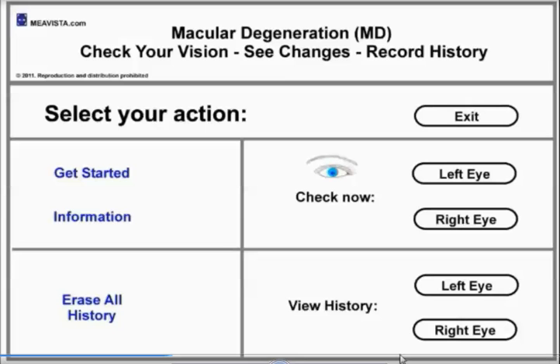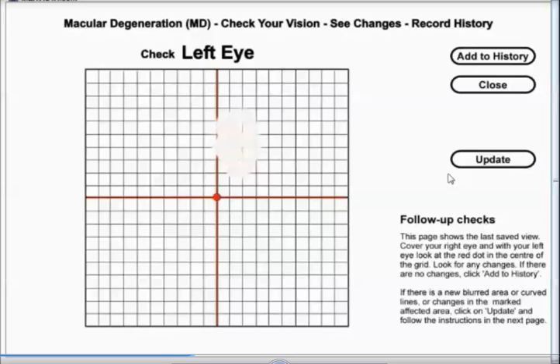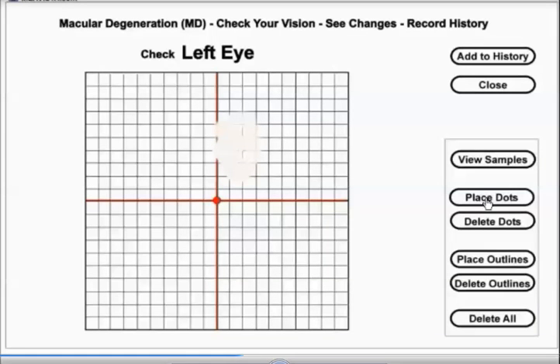Now let's test your left eye. Click on left eye. In this example we have put in a blurred area. So if you come to this screen and you see either a blurred or curved area, click on the update button and then place dots. By clicking on place dots, go around the perimeter placing dots on the affected area.